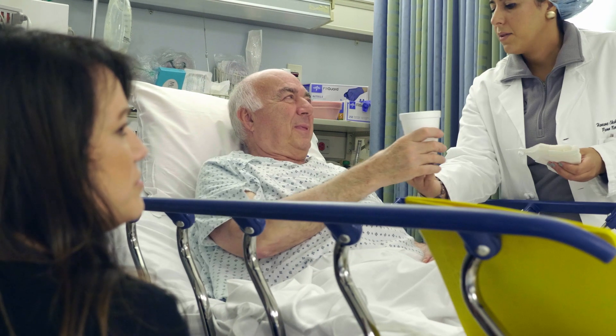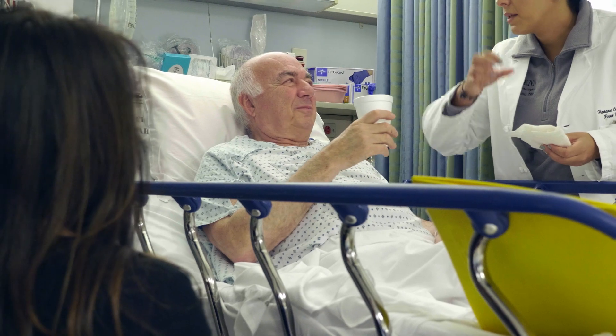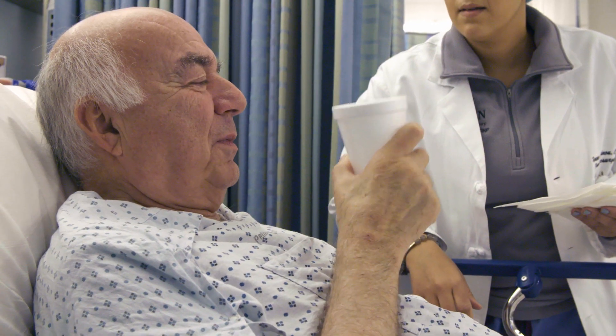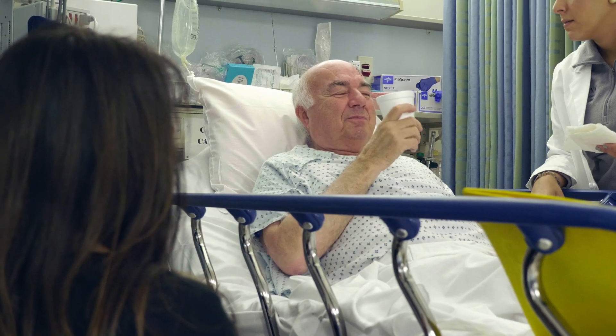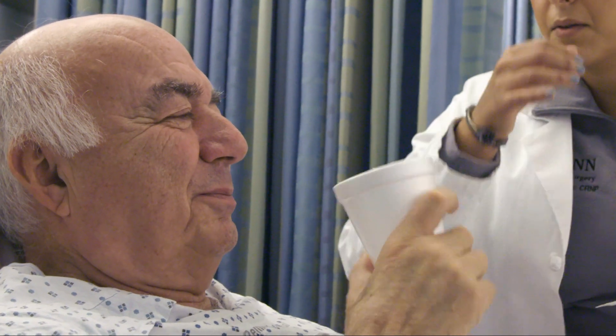All right, so I want you to pretend that you're drinking. Bring the cup to your face. Try to bring it as close as you can to your mouth.